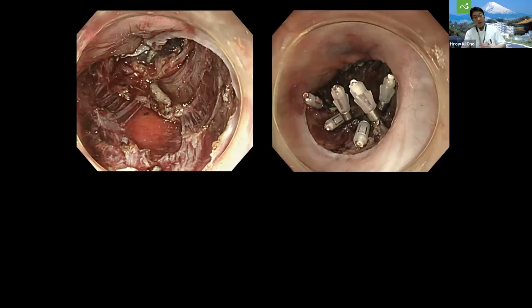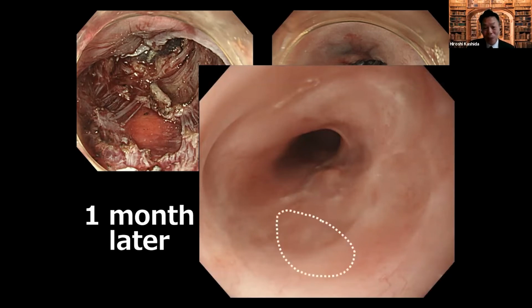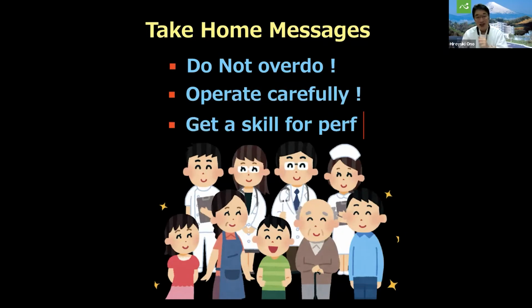And this is a perforation hole, and the right side is after suturing, and 1 month later, completely covered. So maybe, great. Yeah, very quick. A little bit surprised. Only 1 month later, the lesion healed, I think. So I want to say a take-home message. Do not overdo, operate carefully, and get a skill for perforation.